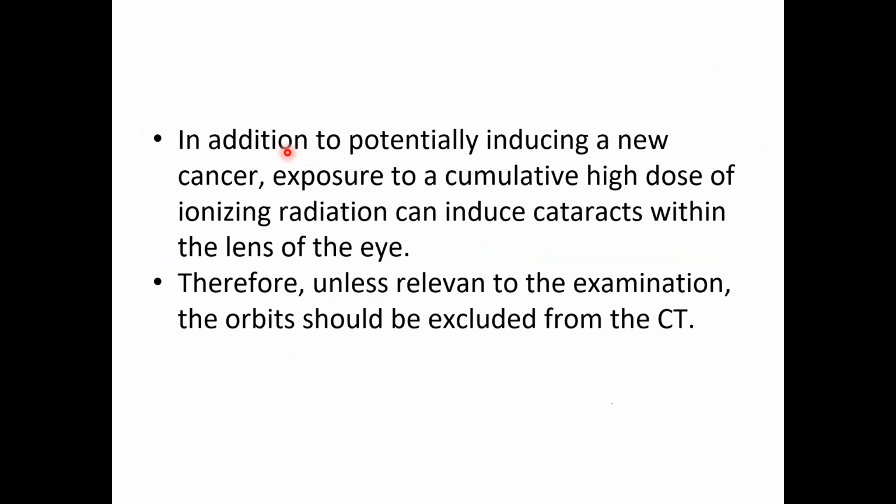In addition to potentially inducing a new cancer, exposure to a cumulative high dose of ionizing radiation can induce cataracts within the lens of the eye. Therefore, unless relevant to the examination, the orbits should be excluded from the CT. You should have a constant thought process that the lens of the eye might get damaged.